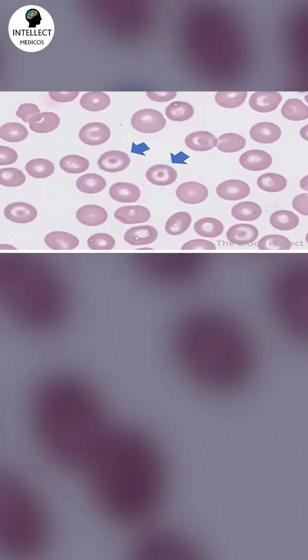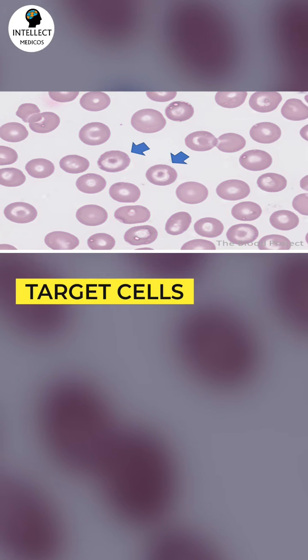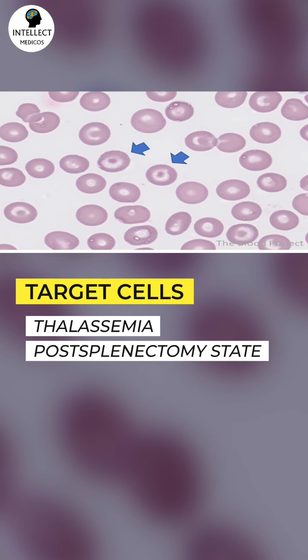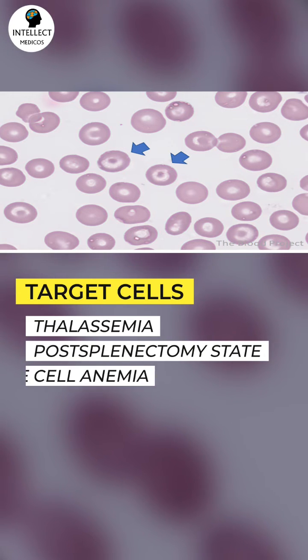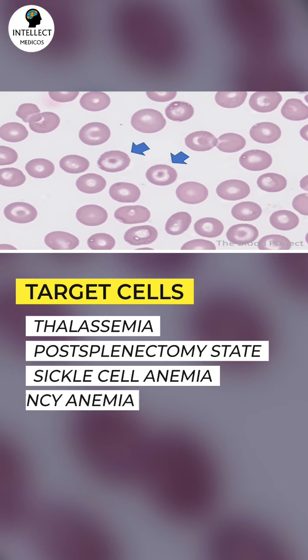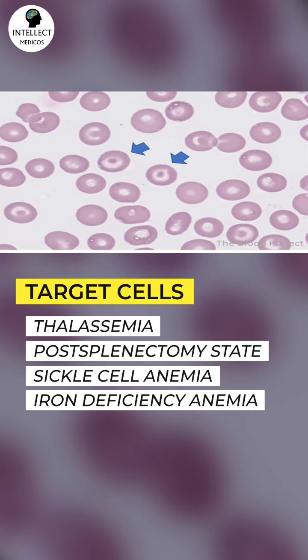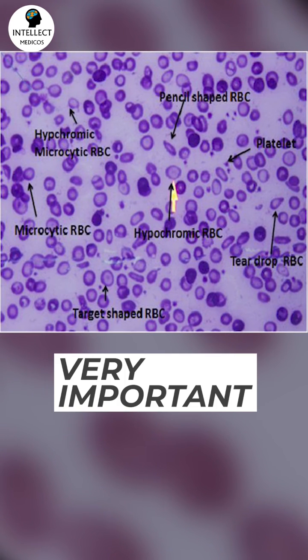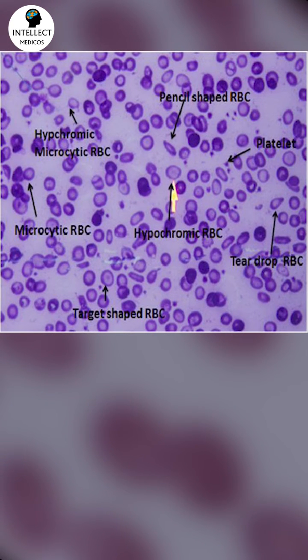The third slide shows target cells, which are commonly seen in thalassemia and post-splenectomy state. They can also be present in sickle cell anemia and iron deficiency anemia.